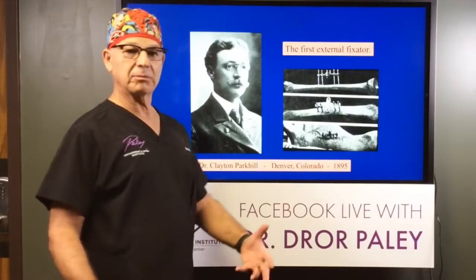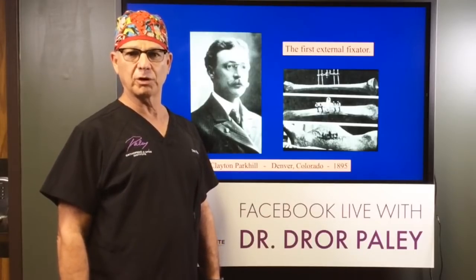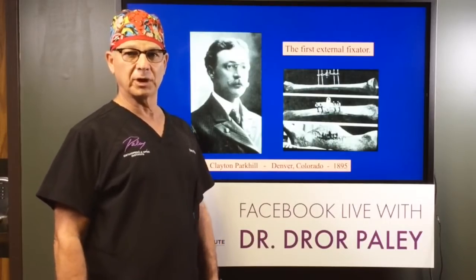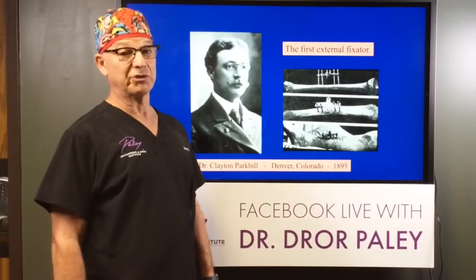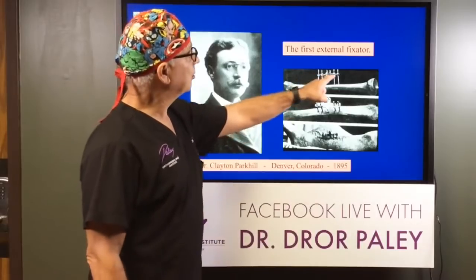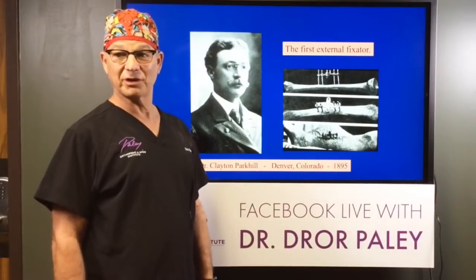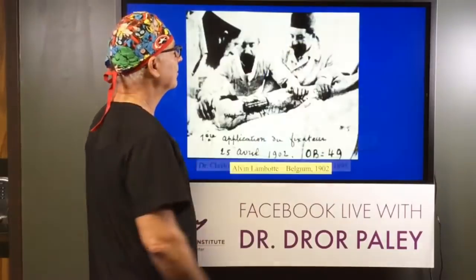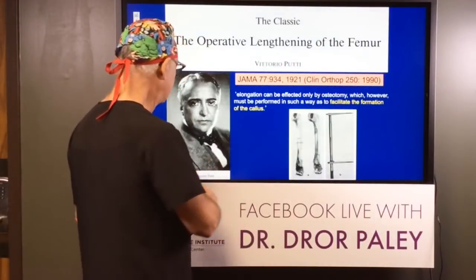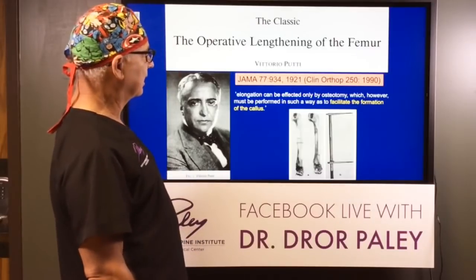And of course, the biggest problem plaguing bone and joint surgeons was fractures, broken bones. And so the first external fixators were used in order to fix broken bones. And this at a time when nothing else was used to fix bones except for a cast. And so you can see a little bar and 4 pins attached to the bone, but 125 years ago. It's amazing to think about that. And in Europe, this also took hold. Albin Lambotte, sorry, that moved, but in 1902 did that in Belgium.